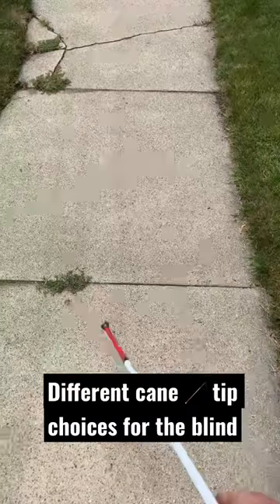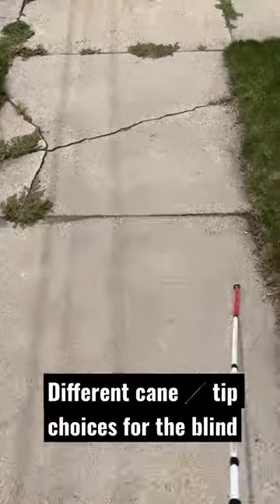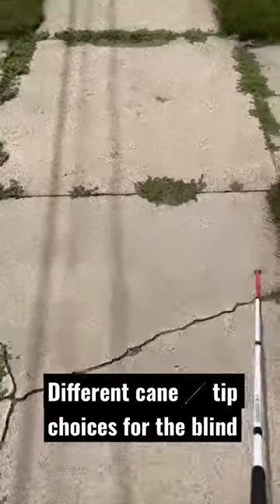Here we have a metal glide cane tip that's primarily used with two-point touch when traveling outdoors along a sidewalk like this one.